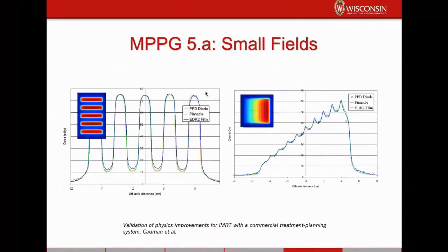These two diagrams come from a paper written in, I think, 2005, so it's about 15 years old now. There's a paper about validation of IMRT dose calculation in Pinnacle. And there are a couple of tests in here that I think are really valuable that I still do, because I think they serve as a good sort of benchmark for how well an algorithm is performing.